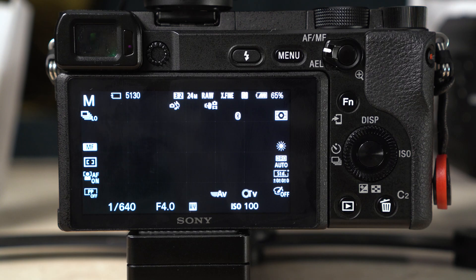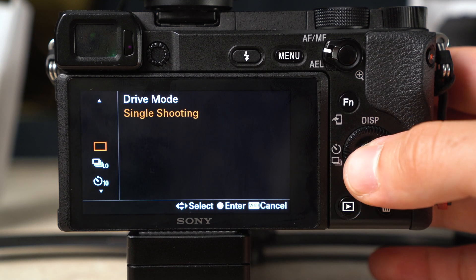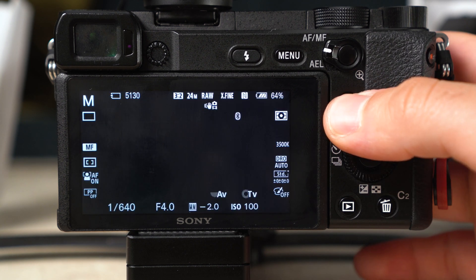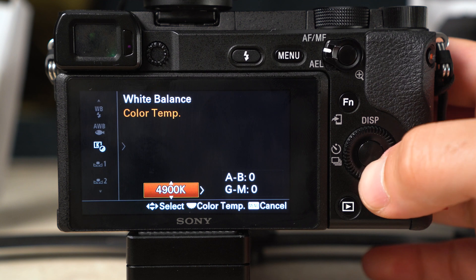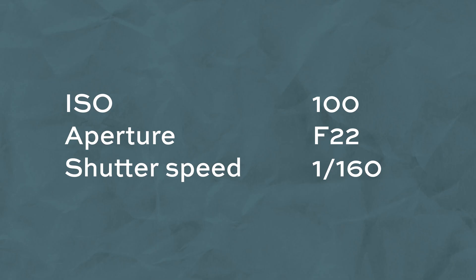Turn the dial to manual mode, then press the function button to open the quick settings. Change the drive mode to Single. If you have the Sony lens, set the white balance to Flash. If you have the Samyang lens, scroll to the custom white balance — labeled C Temp/Filter — and set the temperature to 5800 Kelvin to compensate for the yellow hue. Then press the Fn button to leave the menu. Now set your ISO, shutter speed, and aperture to the settings shown on screen, which I've found work best for intraoral photographs.